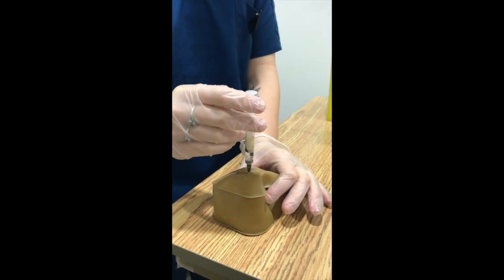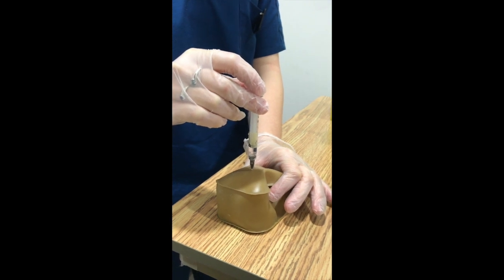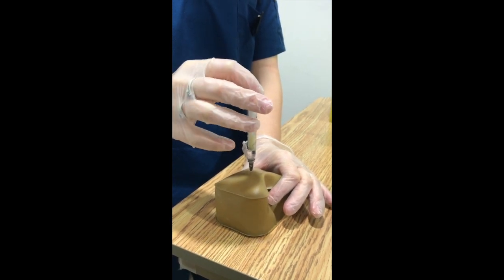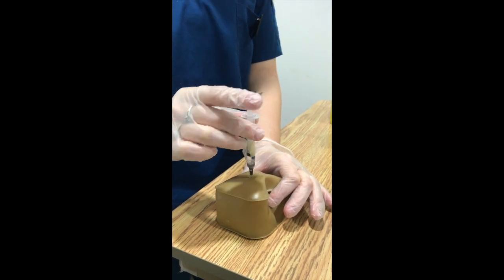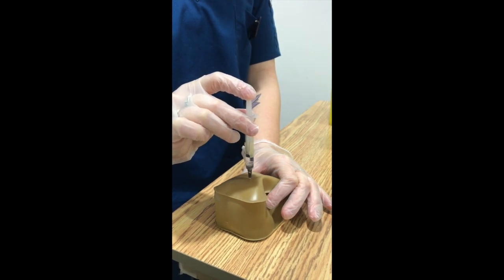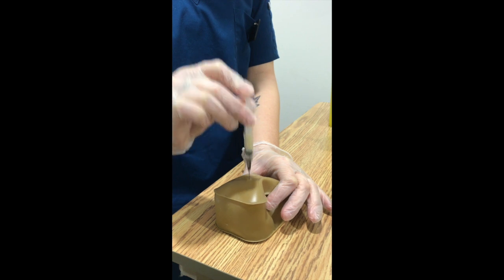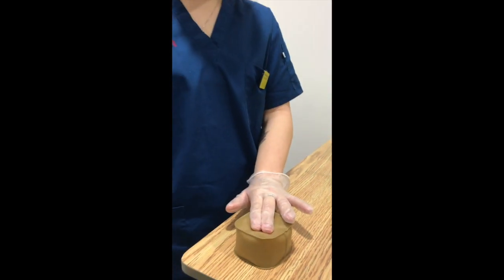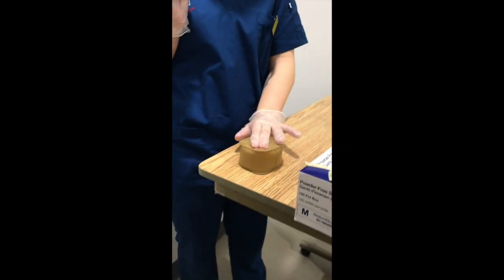And then you're also going to want to aspirate back a little bit, just a tiny little pull on the plunger. If you see a little red ribbon of blood, you know you're in the wrong spot, so you would have to start over. But if you don't see any blood, you're in the right spot and you know you're in the muscle. And then we can just inject right into the muscle, pull the needle straight out, and apply pressure again, and then dispose of the needle right into the sharps container.